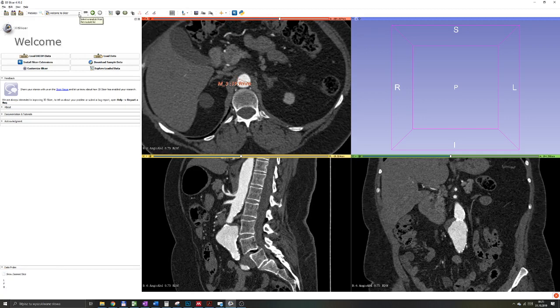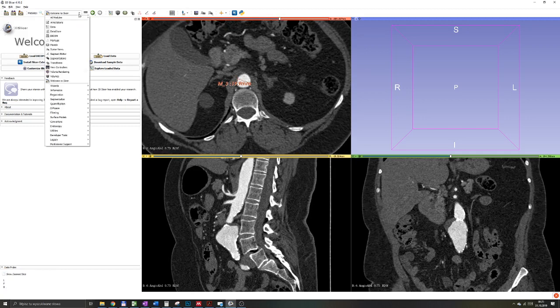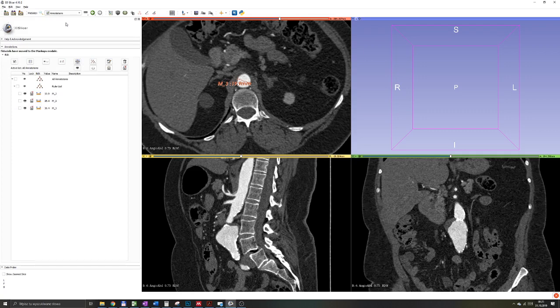When you go to your module navigation bar, you can find all those measurements in annotations module. When you go to annotations, you'll find all of the measurements that have been performed by us, and you can edit pretty much everything.